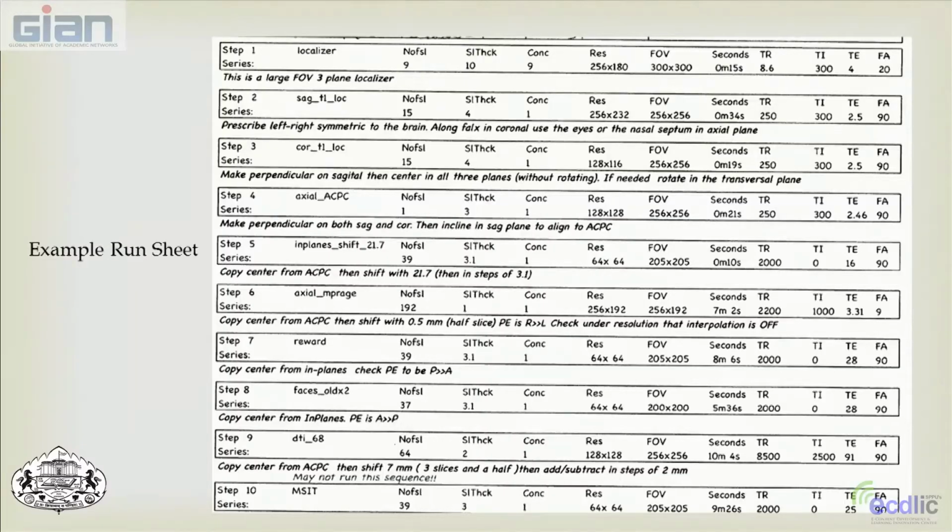Our DTI scan is a long scan. This scan is 10 minutes and 4 seconds long, so this is a very intensive scan. By intense I mean it's really pushing our gradients, the spatial gradients that switch. In fact, the table shakes due to the gradients working so hard during the scan.